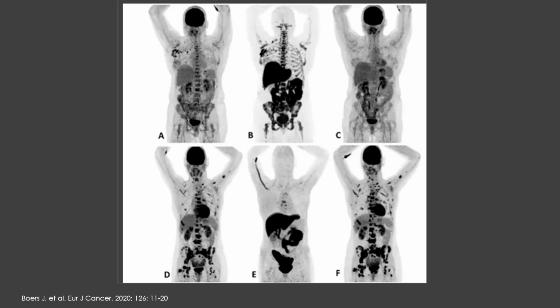The baseline FDG is there in image D. That shows pathologic uptake in multiple skeletal lesions. Image E is the FES study, which only showed very minimally increased ER expression just in the thoracic vertebrae there, as you can see kind of in the chest.